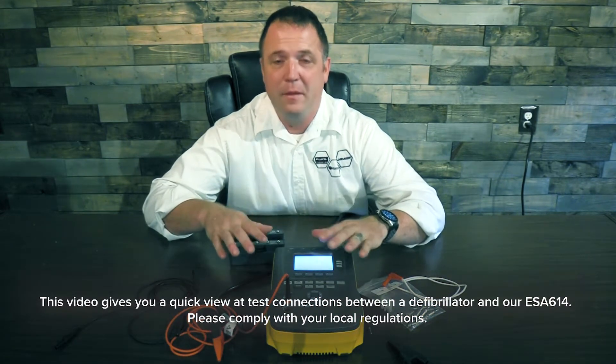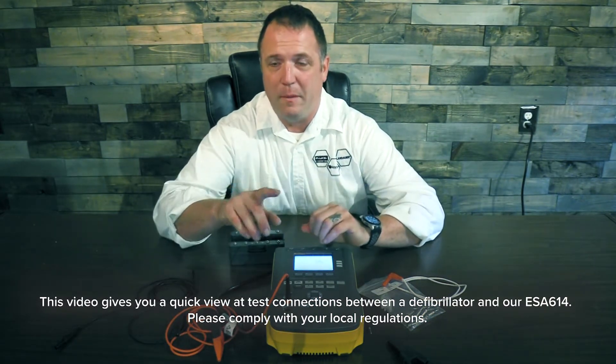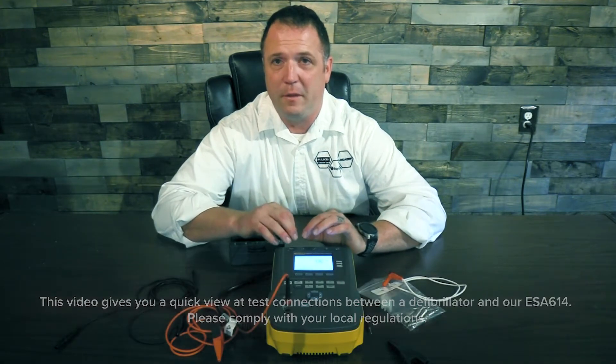Hello, I'm Justin Ross and I'm back. We're going to show you how to connect the ESA 612 1415 to a defibrillator one time.